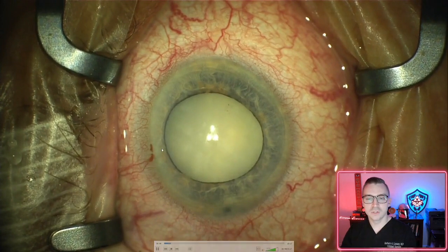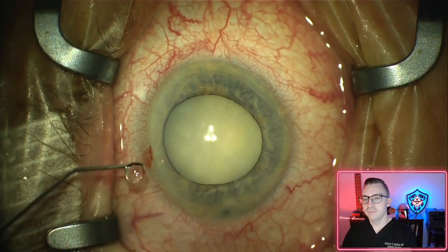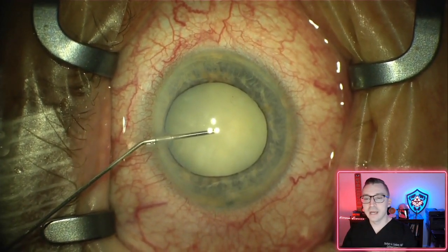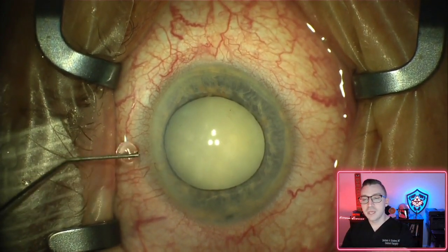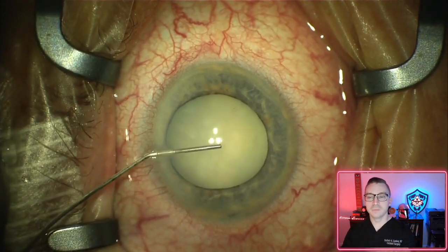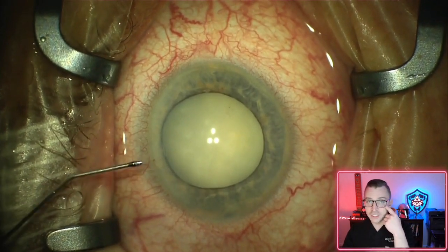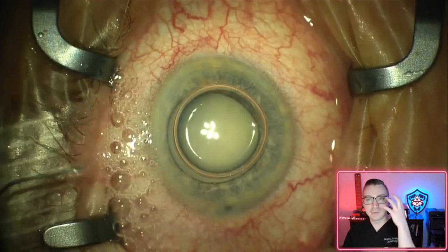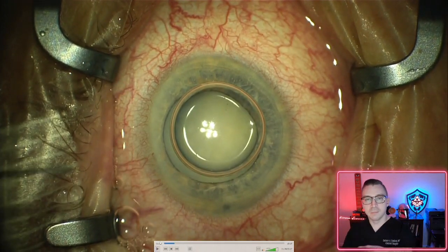You use this to insert fluids into the eye, anesthetic into the eye, viscoelastic into the eye. So we'll walk through that together. Here we are putting in a little bit of lidocaine. Now this is going to supplement the anesthesia that we've already done. This patient, prior to me coming into the operating room, he's already had what's called a block, which is where my anesthesia team will put a small needle through the patient's lower lid and put some anesthetic behind the eye to anesthetize the nerves back there. And then I supplemented that with some lidocaine inside the eye as well.